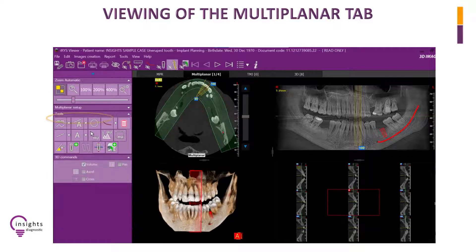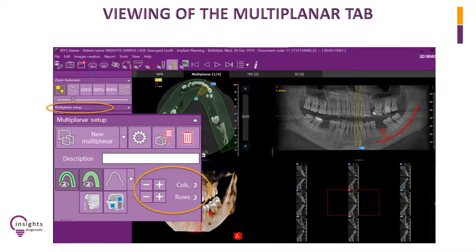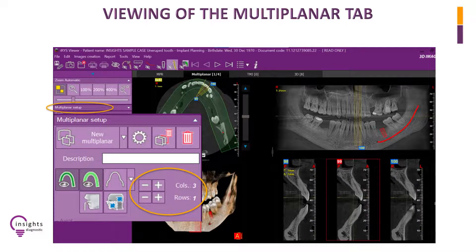The number of views of the cross-sectional slices can be managed by clicking on the Multiplanar Setup drop-down button. The plus buttons increase the number of columns or rows, while the minus buttons do the opposite. Try decreasing the rows to just one for a better view of the cross-sectional slice.